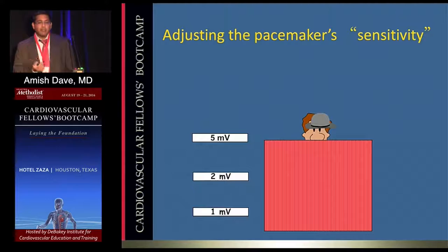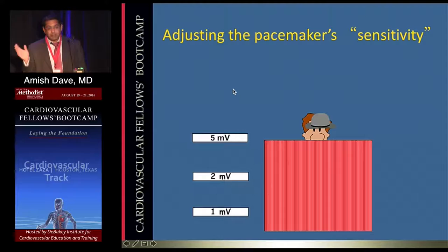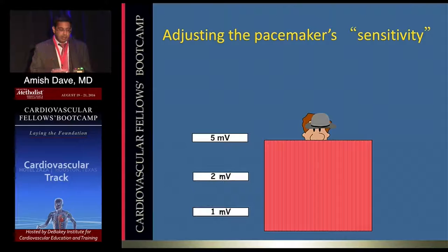In most cases, if a patient has their own heart rhythm, you want the pacemaker to get inhibited whenever the patient has their own QRS. So if the patient has AFib and they're just very slow, whenever they do manage to get their own rhythm, you don't want to necessarily pace right after their own QRS. There's risk to doing that in that you could pace just the wrong time in repolarization and actually induce torsades or other problems. So pacemakers can sense, for the most part, if they're programmed right, an intrinsic rhythm.